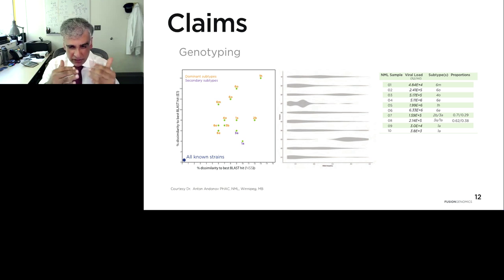So it gives you an idea that because the probes were designed against the evolutionary lineages, they were able to go and capture the hepatitis C genome, which had mutated to such an extent. All the samples in this study were things like these. There were also even more interesting samples.